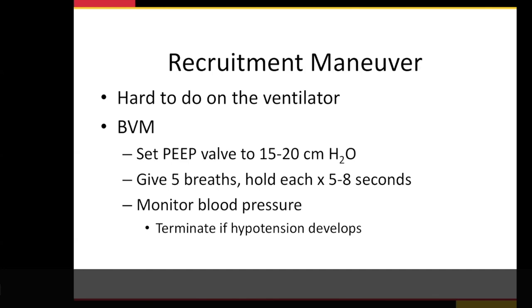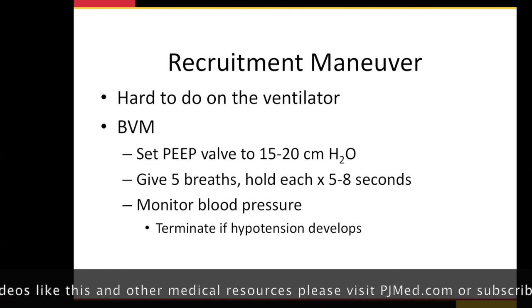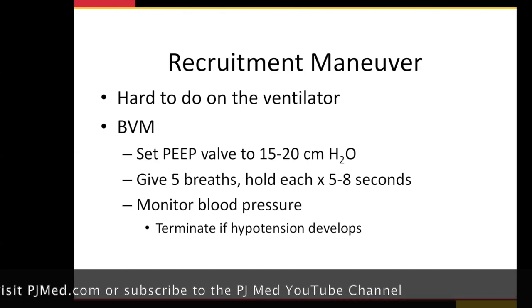We can do it on the ventilator. Again, I'm not going to go advanced on you. There's lots of ways we can do this. But what we're trying to do is recruit the lungs so that they slowly re-expand a little bit more. And now we get more oxygenation, more alveoli that are open to exchange oxygen.